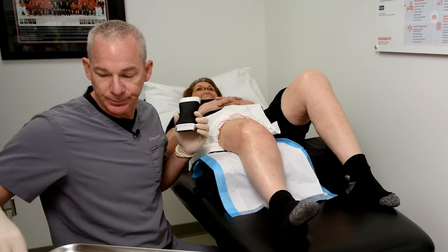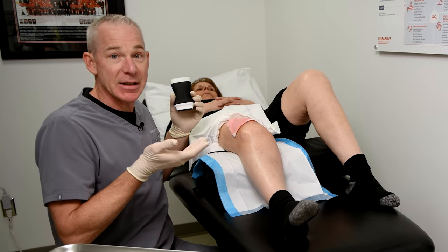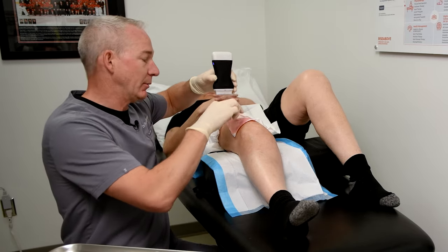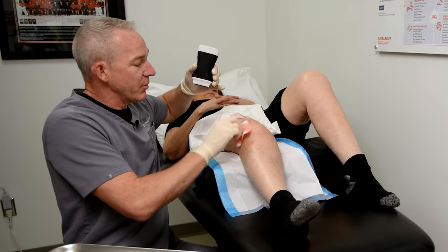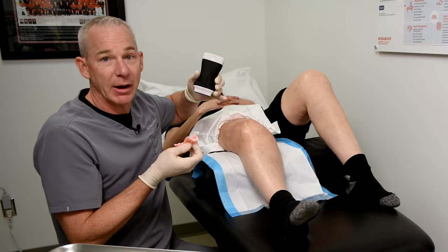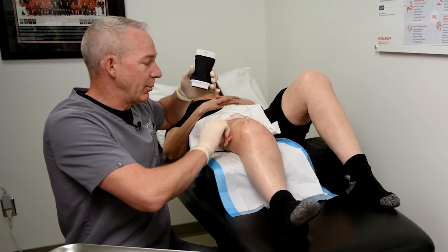So we'll do the drainage now. First things first, I've got my table nice and high. I strongly suggest you get your eye at the level of the needle. I've got an absorptive towel on the bottom because normally when I drain the knee, either a bit of blood will trickle down or a bit of the serous fluid that I drain from the knee will trickle down, and you certainly don't want that on your table.